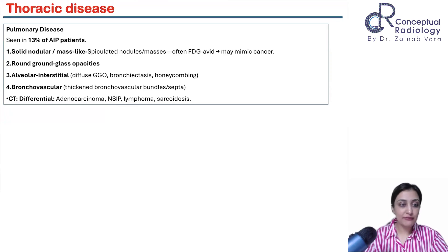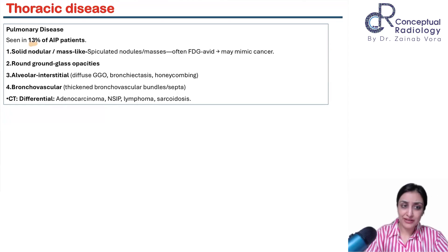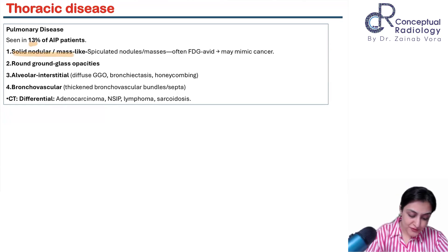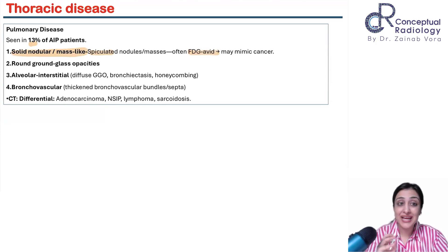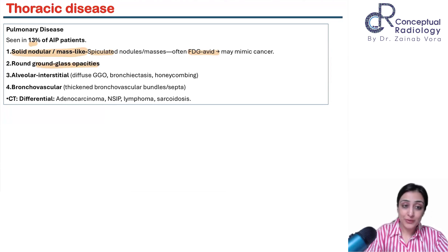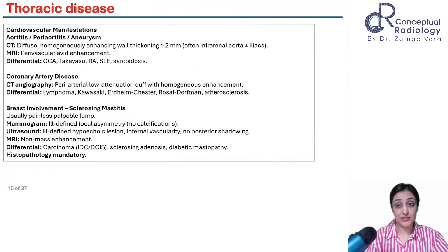Lungs are affected in 13% of cases — not very common. Four patterns: solid nodules mimicking cancer (FDG-avid with spiculated margins), ground-glass opacities, interstitial thickening, and bronchovascular thickening.